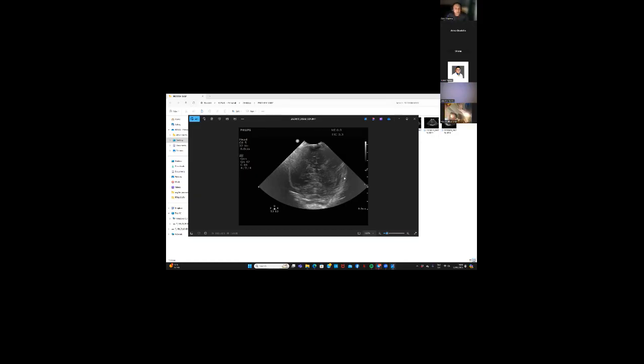Now ventricles are visible with choroids. Well done. Here we can see bilateral choroids. So if you go back, just to reassure people, these aren't cysts. These two, they're not cysts. Basically, it's a little bit of artifact that you're getting over there, commonly seen, especially because your gain settings are a little bit on the low side. So it's not unusual that the paraventricular brightness might be interpreted that way. They're not cysts. This is normal.